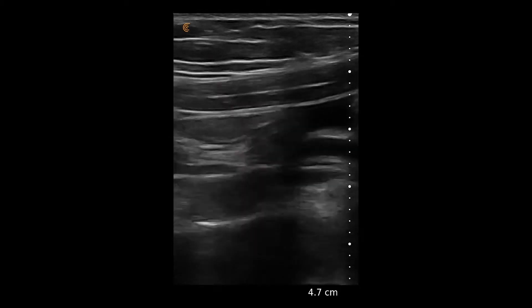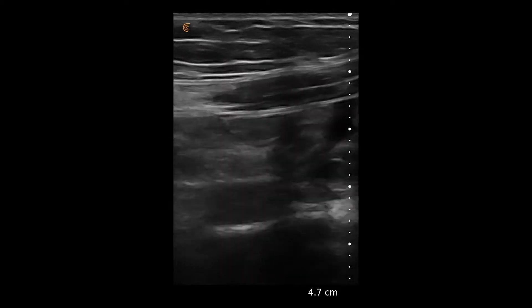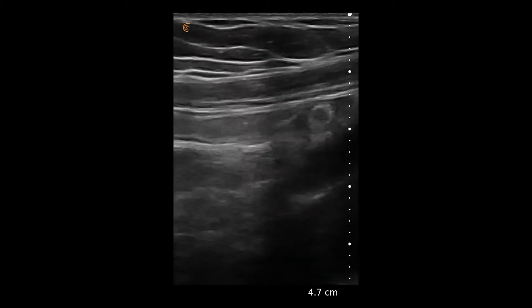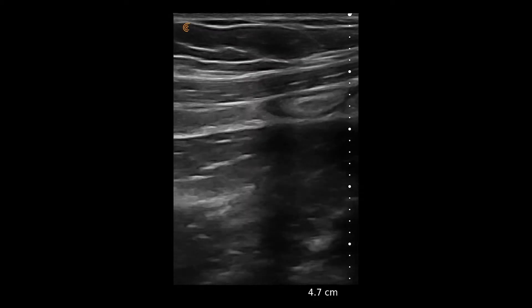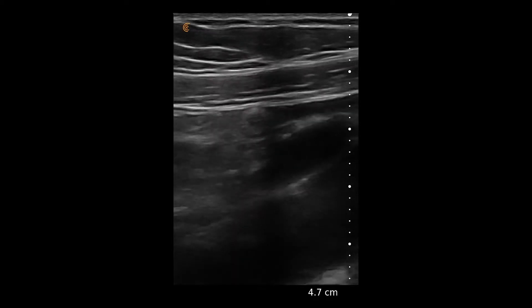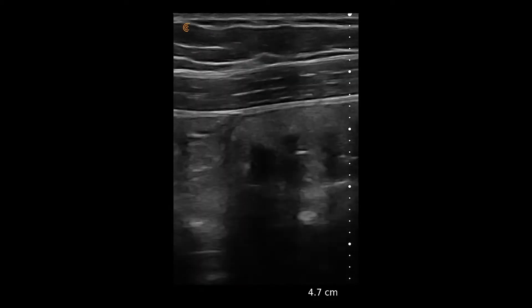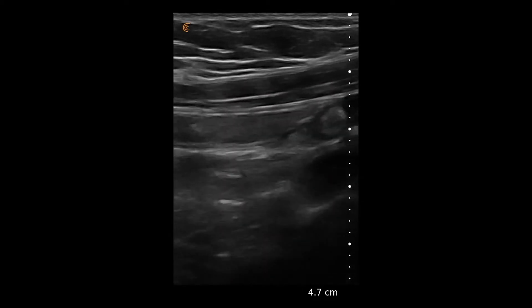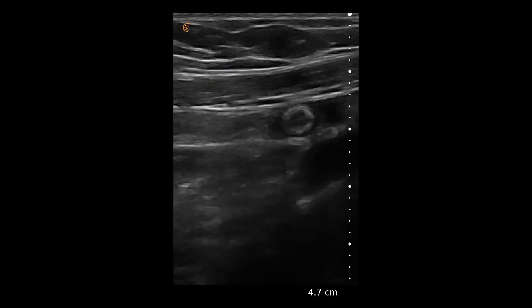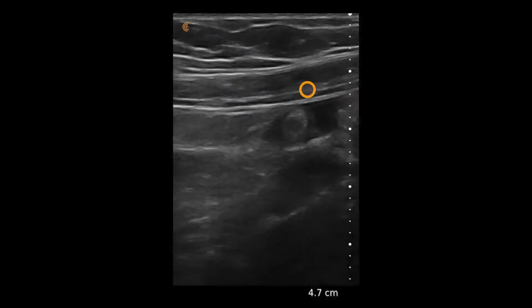In this video, we see the linear scanner on a small parts preset placed in a transverse or oblique plane in the right lower quadrant of a patient who's presenting with abdominal pain. Immediately coming into view are the superficial layers of the abdominal wall musculature.